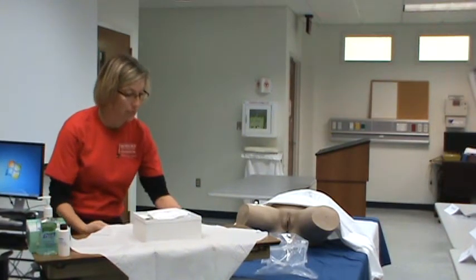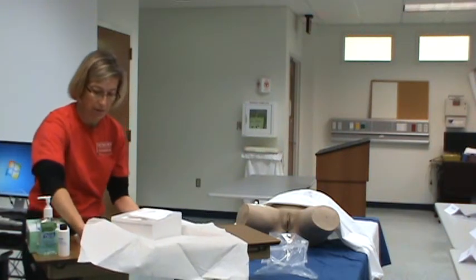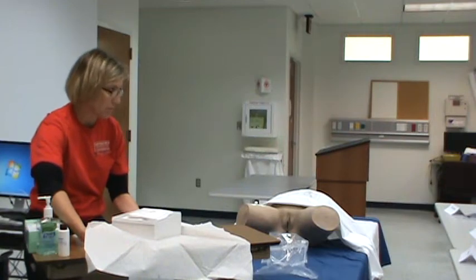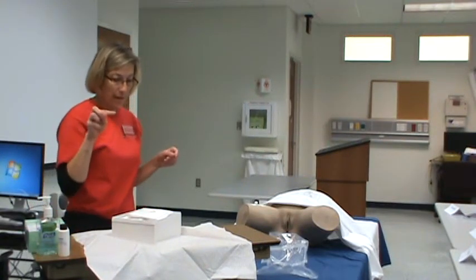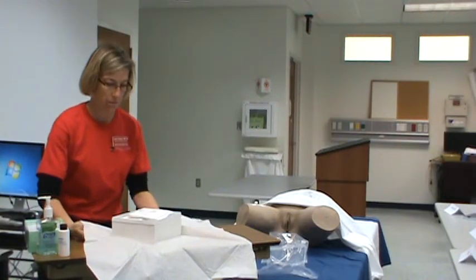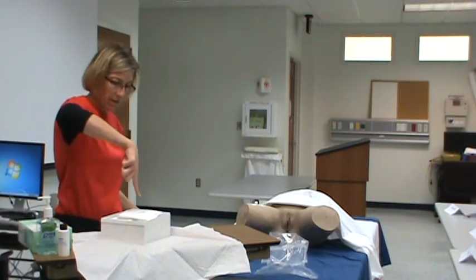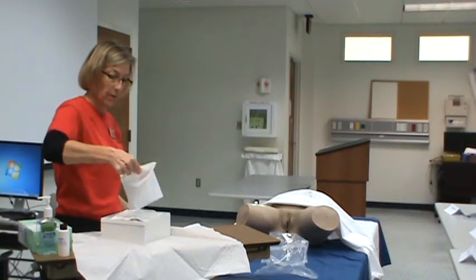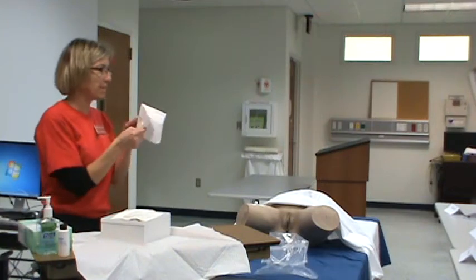Okay, so in this particular kit, what I'm going to do, and you can do this because remember, underneath is not sterile, I can move my kit around a little bit. Or what I'm moving is my drape, because eventually I'm going to move the kit and situate it a little bit differently because I don't like the way it is. Watch how I take my finger and I push down on it so that this lifts up. So I'm not touching anything in my sterile box in my Foley kit.